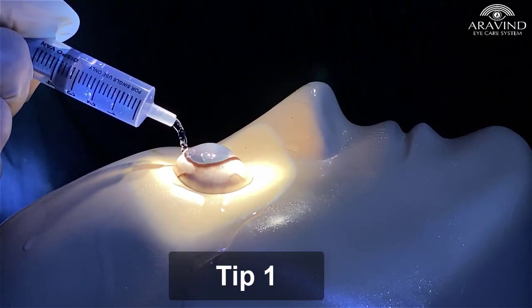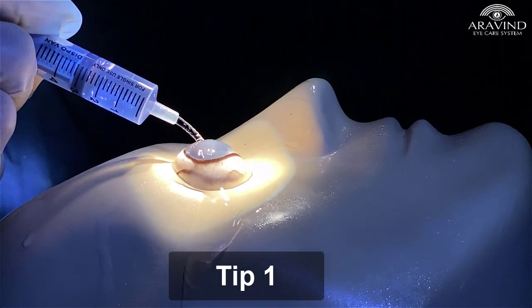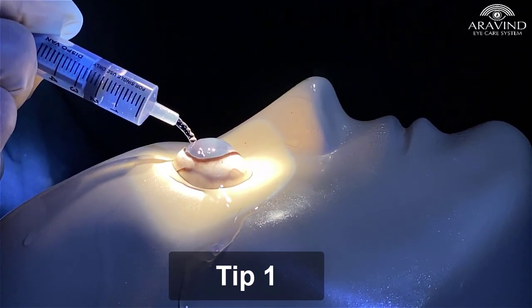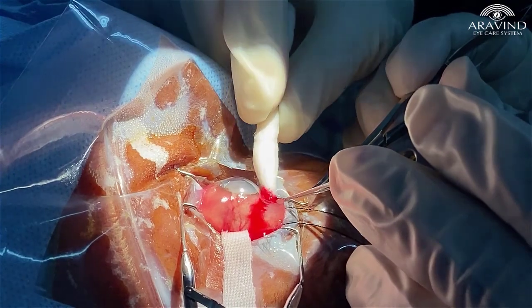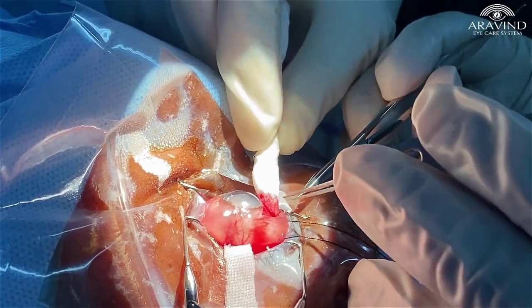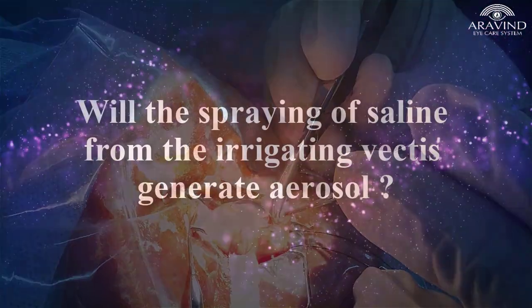Gently flushing over the cornea without the cannula reduces aerosolization. Also, a sponge can be used to mop any blood at the incision site.